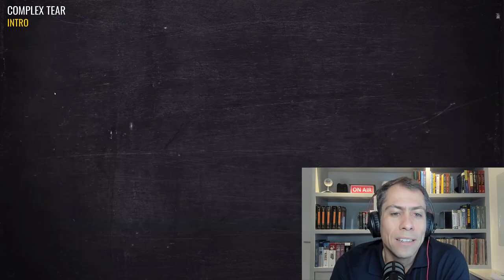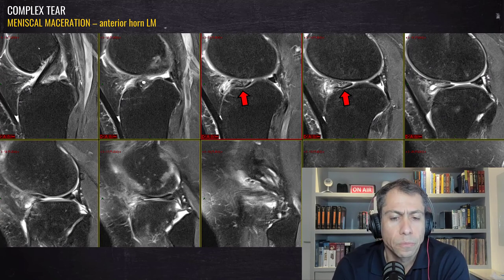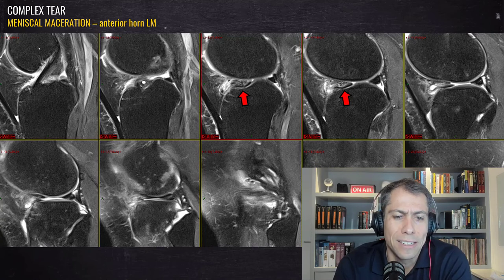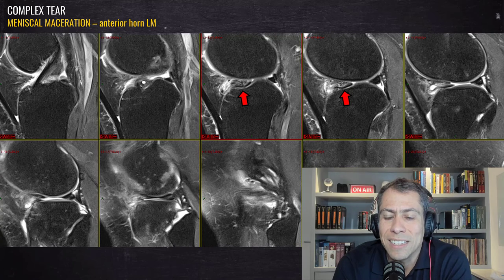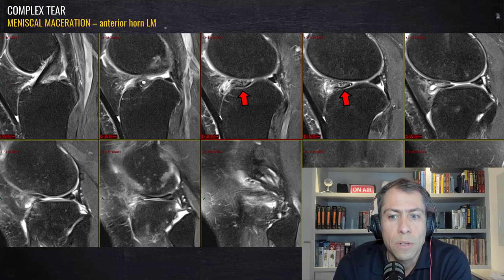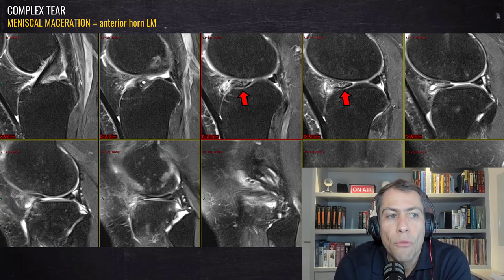In the third example, I'd like to show an example of meniscal maceration. Sometimes it's hard to differentiate between a complex tear and a meniscal maceration, but the basic point is this: in meniscal maceration it's difficult to identify the meniscal margins, it's difficult to identify the meniscal morphology, and it's also difficult to identify the patterns of meniscal tear.